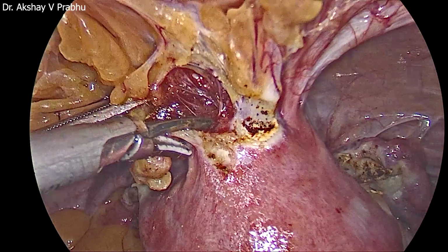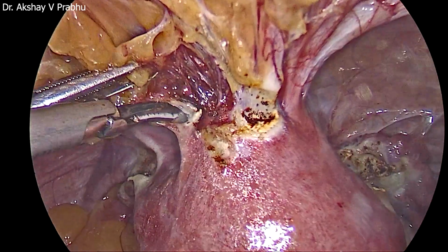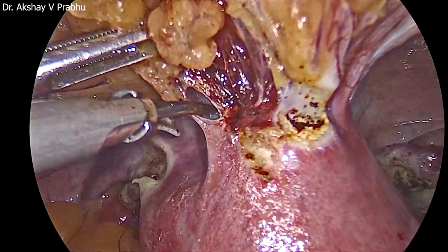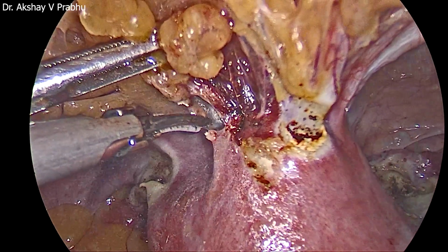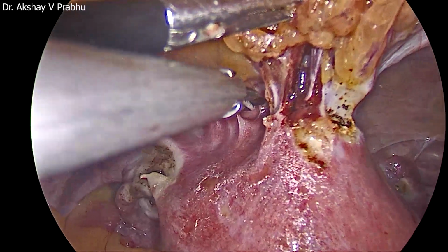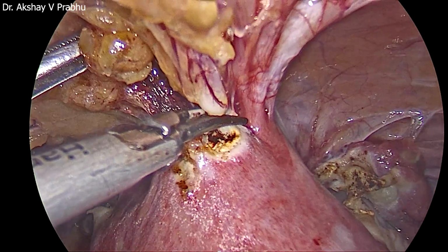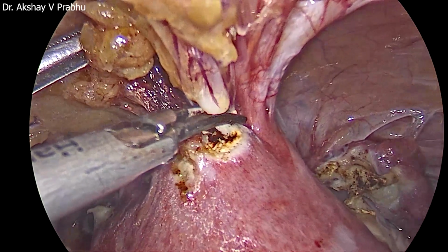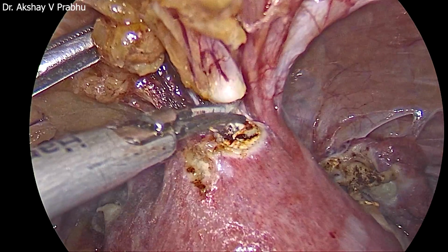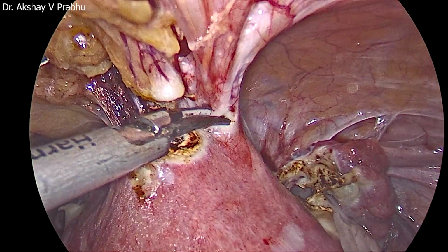It's basically more than bladder adhesions, an adhesion band which has formed between the uterus and the anterior abdominal wall. So I'm trying to cut millimeter by millimeter. That word is very important. Go millimeter by millimeter. Don't take this in chunks. You're trying to see, because with every single cut of yours, the adhesion band or the adhesion tissue gets everted because the uterus is on stretch.